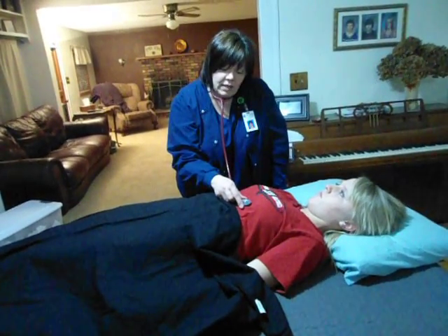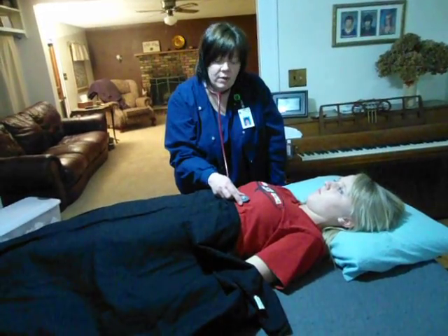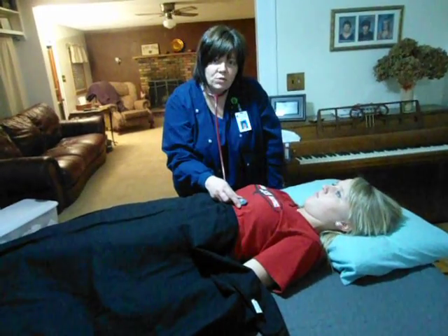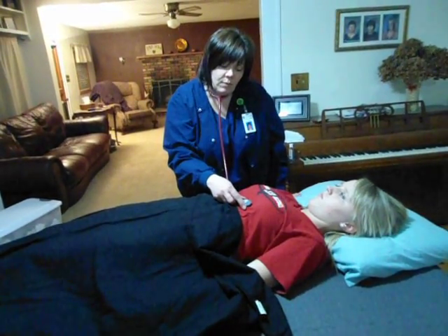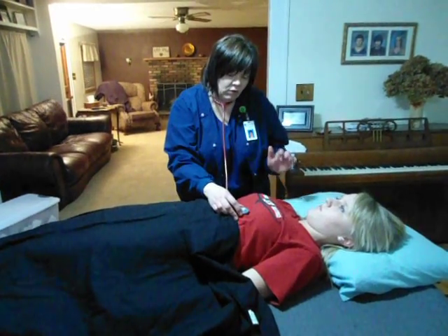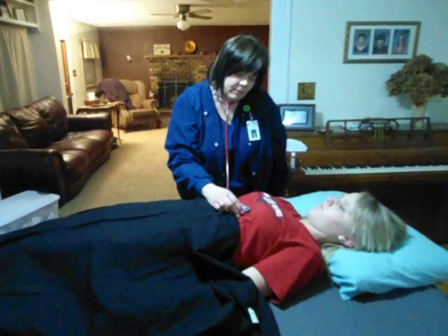I'm going to be listening for the S1 and S2 sounds. The S1 is the lub and the S2 is the dub, and actually the S1 is heard best over the mitral area. It's when the mitral is closing, and you'll hear it really loud at this spot. But the S2, you're going to hear it faint here, but you're going to hear it better over in the aortic area. So I'm going to listen there.